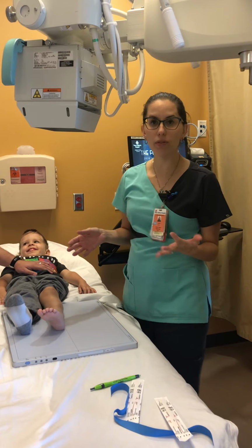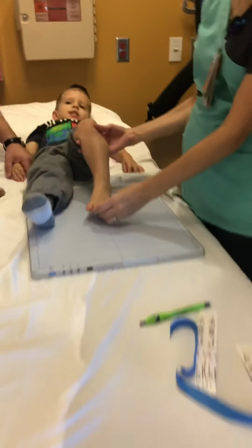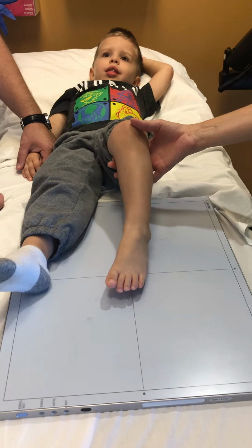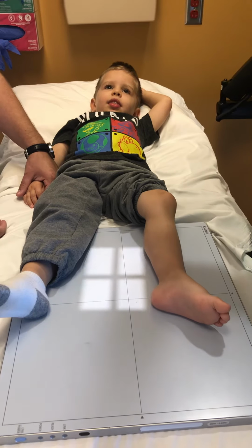In this series, we're going to talk about toe x-rays. To start off with, you'd have your AP just like you would normally. So we're going to put those toes actually in the center there, and we're going to do an AP foot. Okay, so we talked about before, 15 degrees.